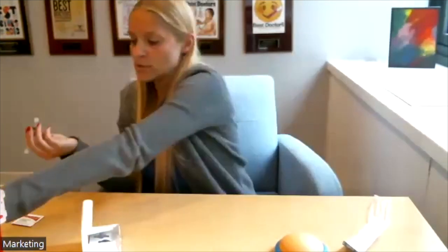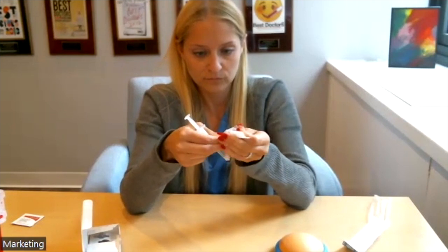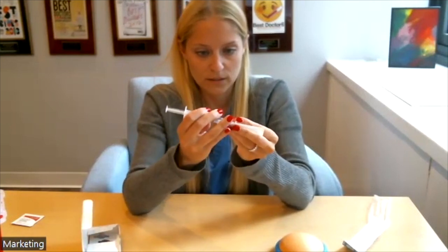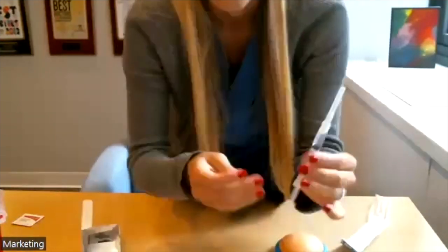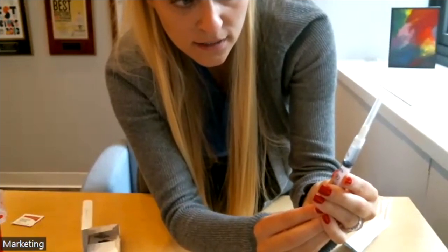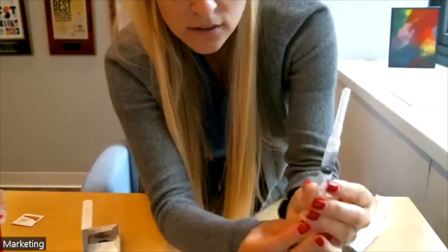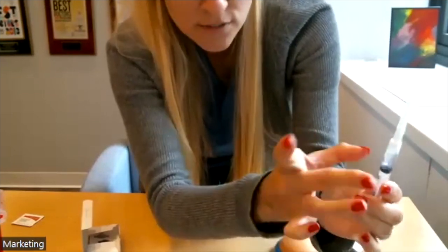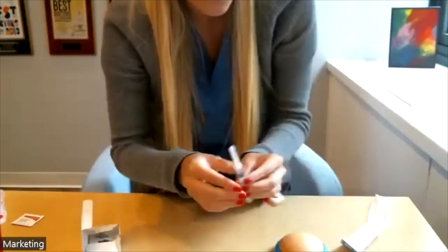Now attach your half-inch needle for the injection — this is the 27-gauge half-inch needle. Screw it on tight. Similar to what we did with the Ganirelix, push up slowly until you see some of the medication come out at the top of the needle so you know it's primed. If you see any air bubbles, aggressively flick them out and they will go away. Now the needle's primed and you're ready to do the injection.